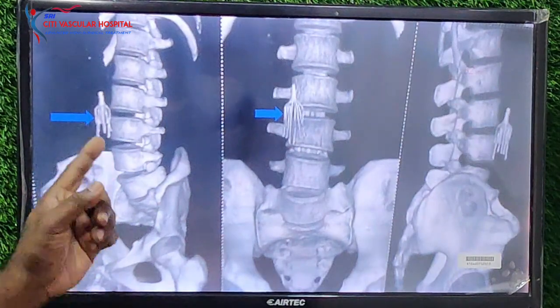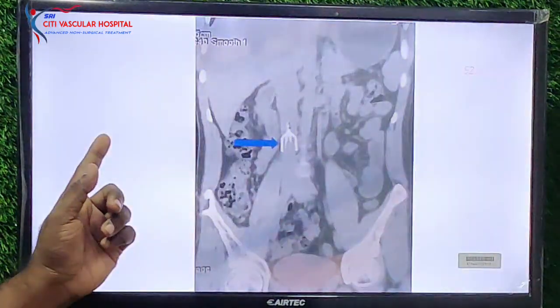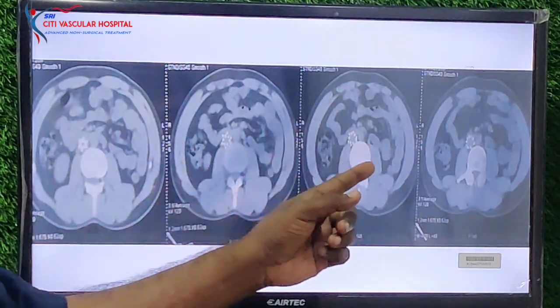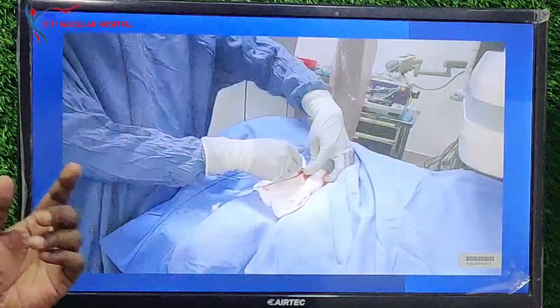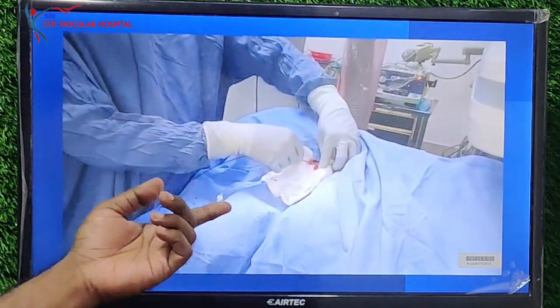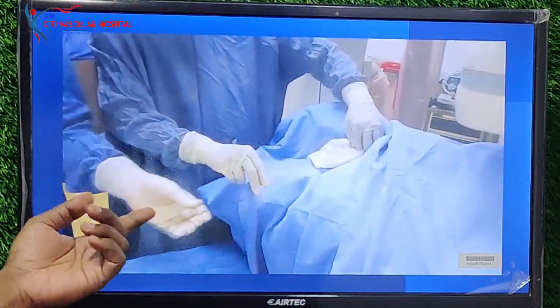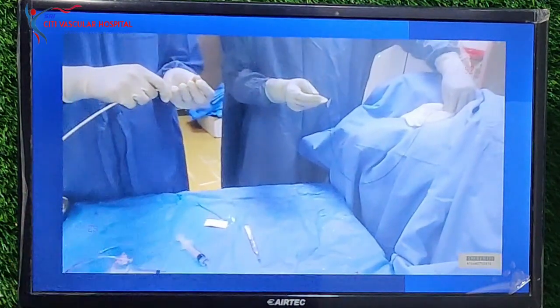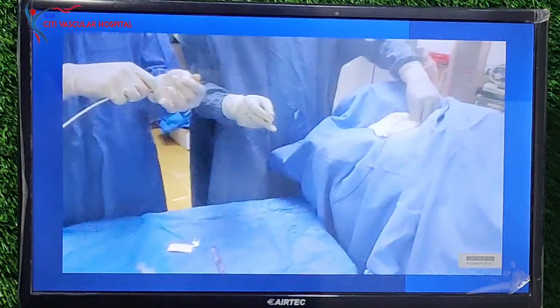A CT scan was done and there you can see the IVC filter in the infrarenal location in the coronal image, and in the axial images. On x-ray fluoroscopy, we have taken the jugular puncture and placed a long 8 French sheath over a regular 0.035 wire. Once we are in position, we will take an angiogram to see the flow in the IVC.